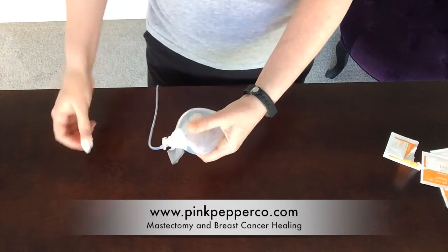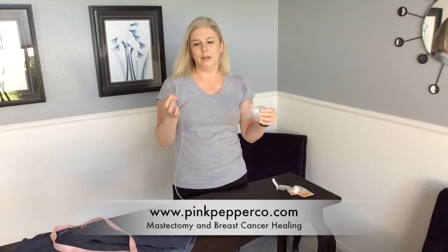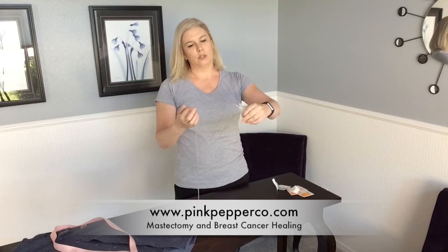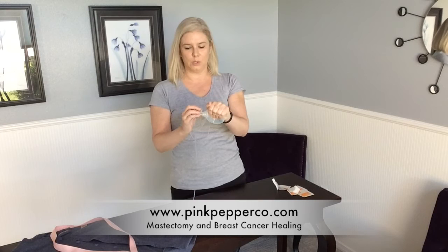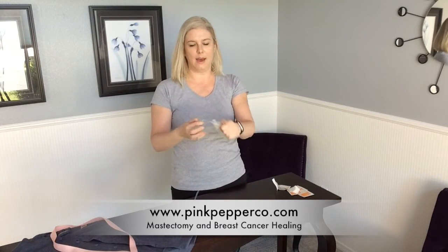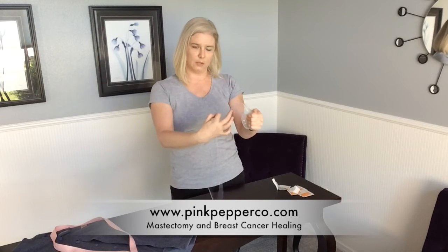One of the other things you do after you drain it is you're going to crimp the line so that no air gets back. You're going to squeeze it really good so it's completely flat, and then you're going to close it like that so that it gets that suction, so that you always have the flow going this way.